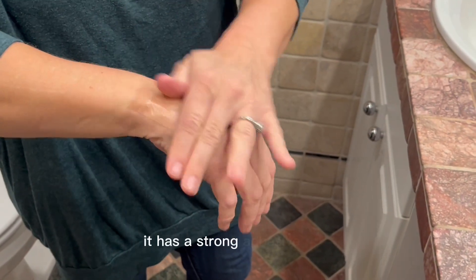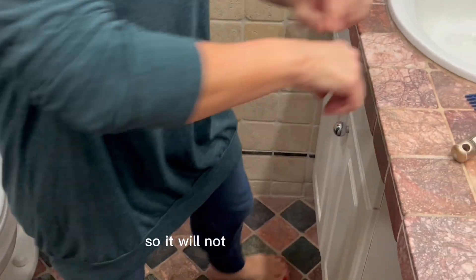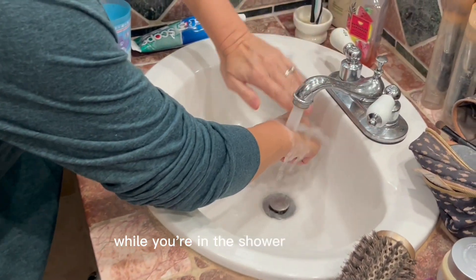It has a strong adhesive hold and it is waterproof as well, so it will not come off easily while you're in the shower or the bath.